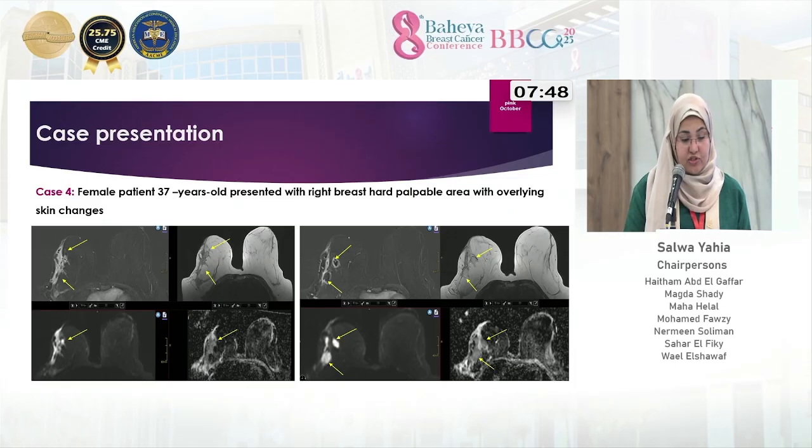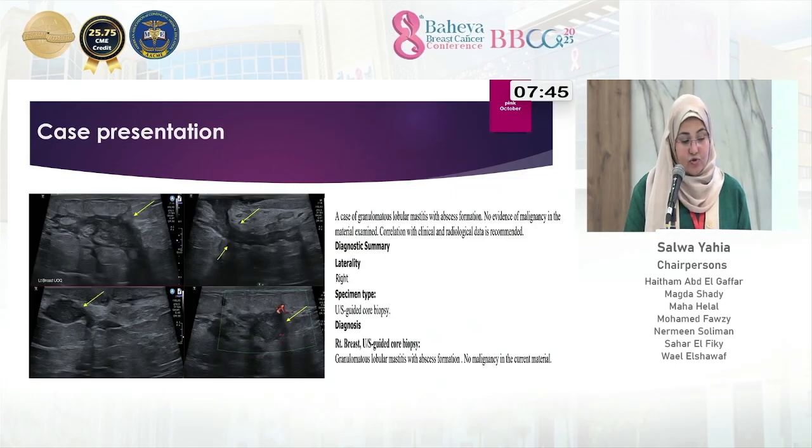denoting abscess formation. Complementary ultrasound showing aggressive parenchymal pathological process with formation of multiple intercommunicating branching pockets of collections, some of them tracking toward the skin. Pathologically proven granulomatous lobular mastitis with abscess formation.